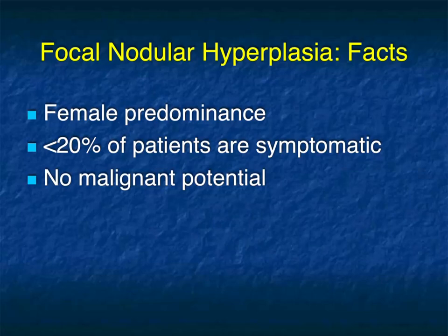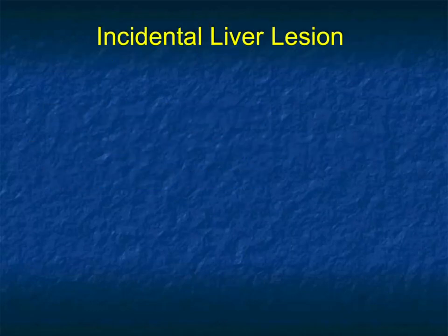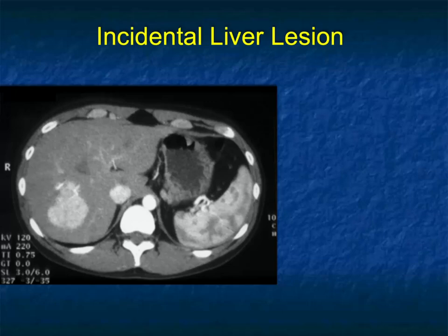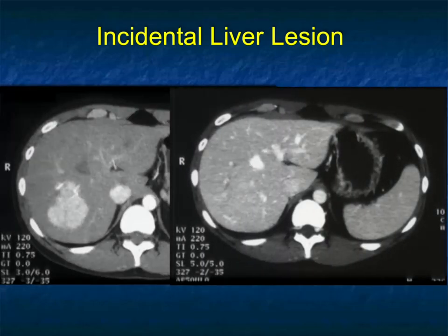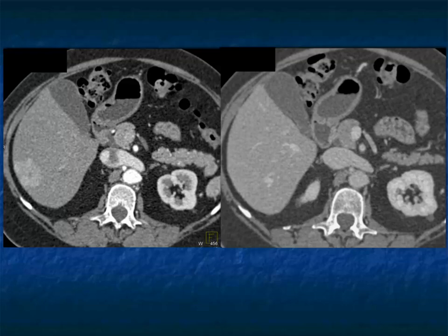FNH is a benign lesion — there's no malignant potential and no chance of spontaneous bleeding. The majority are asymptomatic, which makes it a bit of a challenge. We talk about an incidental lesion: on arterial phase imaging there's a vascular lesion in the right lobe of the liver. Could this be a hemangioma? It doesn't quite look like that — it's not peripheral enhancement. Could this be metastasis or hepatoma? Those are definite possibilities, but the lesion becomes totally isodense on venous phase imaging. Hepatomas and vascular mets can become isodense, though usually not that quickly.